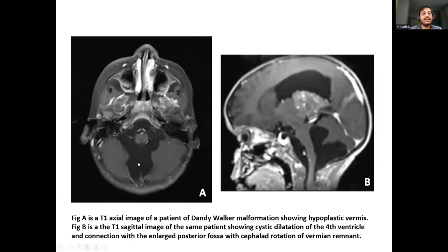A T1 axial image of a patient with Dandy-Walker malformation shows a hypoplastic vermis. Figure B is a sagittal T1 image of the same patient showing cystic dilatation of the fourth ventricle with connection to the enlarged posterior fossa and cranial rotation of the remnant of the vermis.